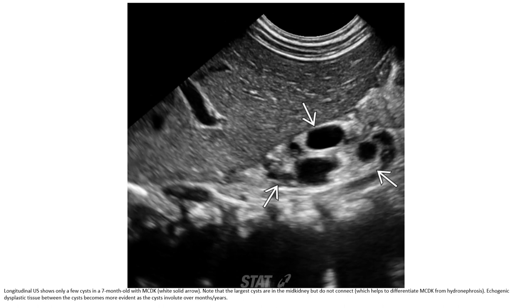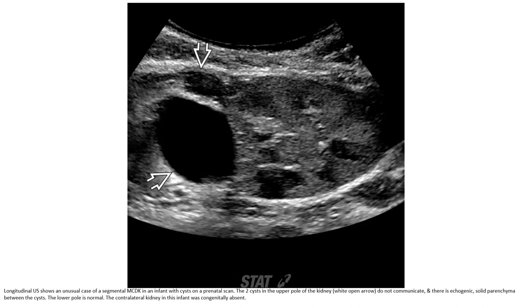Another ultrasound shows only a few cysts in a seven-month-old with multi-cystic dysplastic kidney. Note that the larger cysts are in the mid kidney but do not connect. The echogenic dysplastic tissue between the cysts becomes more evident as the cysts involute over many years.